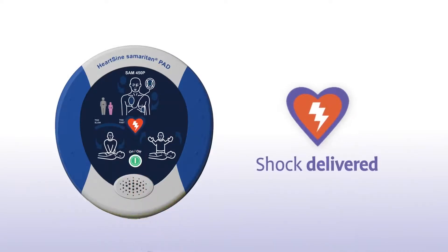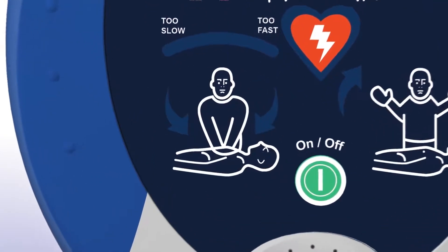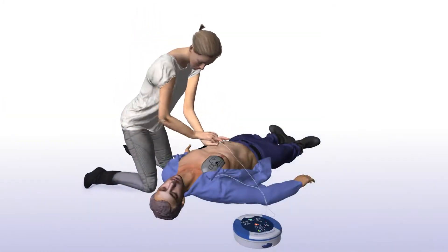Press the orange shock button now. Once the shock is delivered, the SAM 450P with CPR Rate Advisor will prompt you to begin CPR and will continue to do so until you begin chest compressions: "Begin CPR. It is safe to touch the patient."